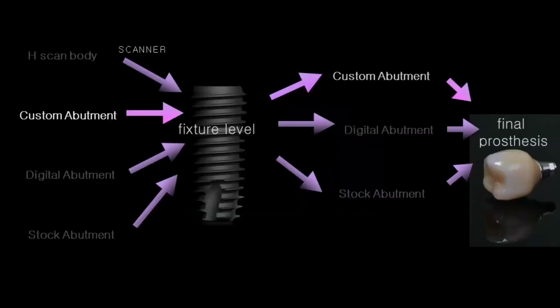Now, this is the second case. We can even take a scan with a custom abutment in place and obtain the impression. Now, let's go back and think about what we did when we used the analog method. How do we obtain the location of the subgingival margin? The impression does not come off easily, and there is excess cement, right?